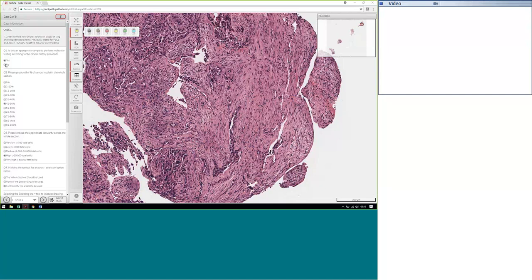The tumour content that would result from that is difficult to assess, and for that reason the experts increased the range, where we thought it's going to be somewhere between 11 and 30%. I think this is typical of these types of biopsies where it is difficult to come down to a definitive category. So we know that it's probably sufficient in that it's greater than 10%, and for some downstream applications which may require 40% or greater, it's coming onto the borderline content.